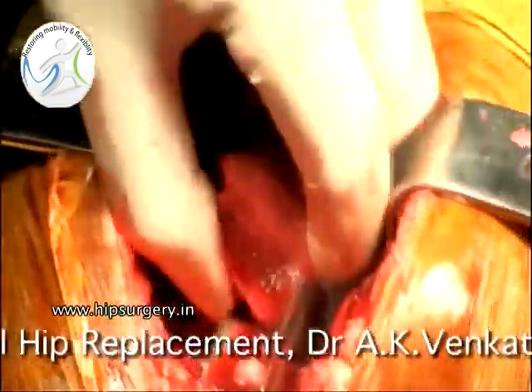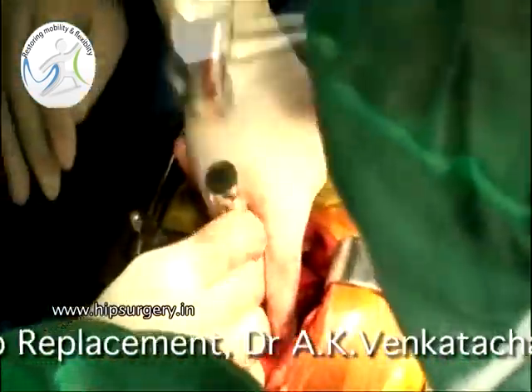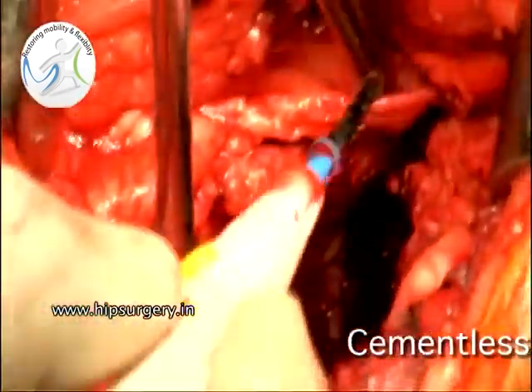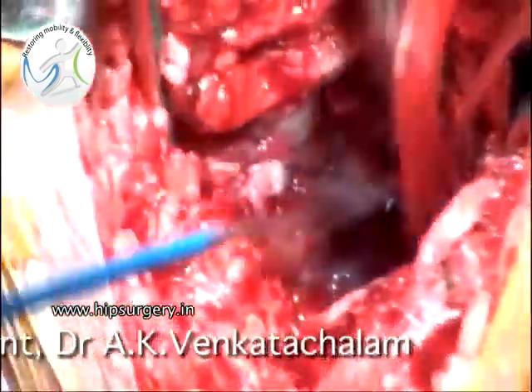This is the head and neck of the diseased femur. One can now see the wall of the acetabulum, which is deficient, and this is the floor of the acetabulum.